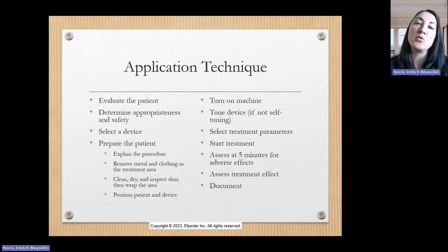So in the thermal diathermy, most of the time, the frequency, everything is already preset, and all you do is increase the intensity, and you tell the patient, tell me when you feel a mildly warm sensation. And then you turn up the intensity until they feel that it's mildly warm, and then you leave it there, but you continue to check on them so it's not getting too hot. Versus with non-thermal, typically they're all set. So with thermal, we typically use a duration of around 20 minutes for that type of diathermy.